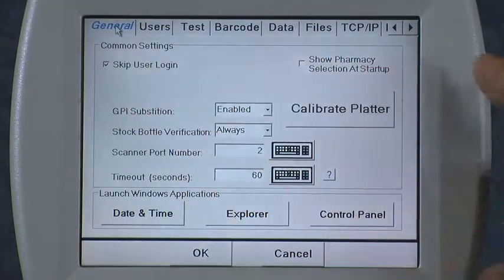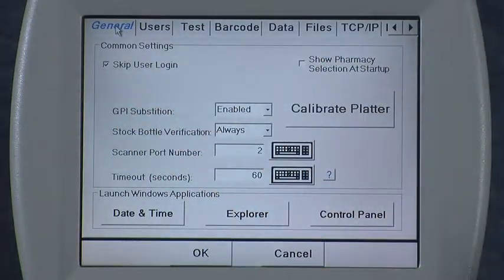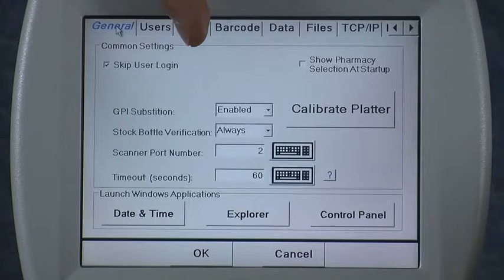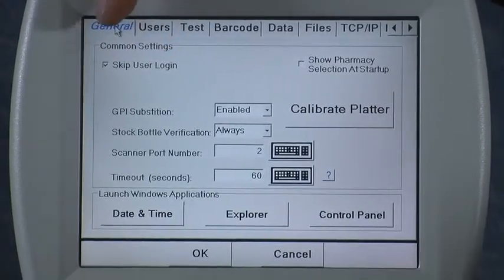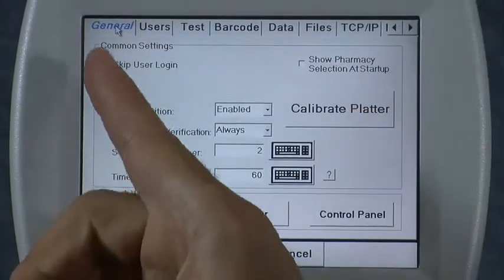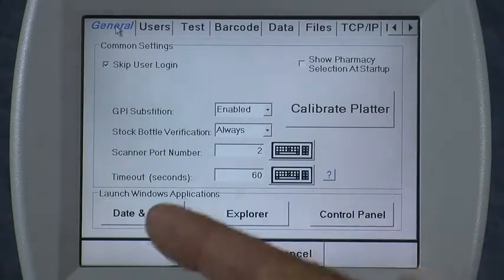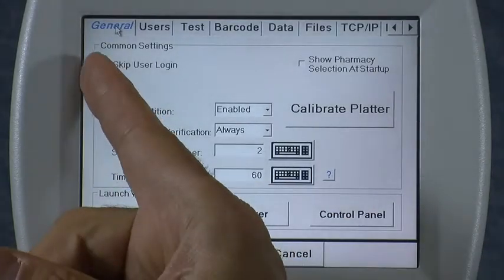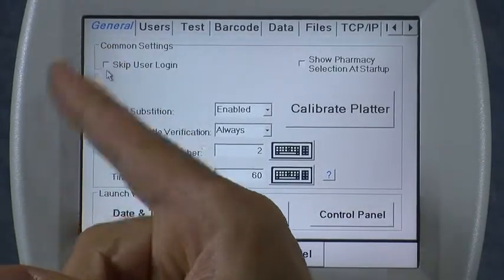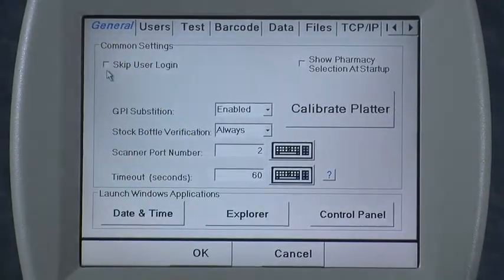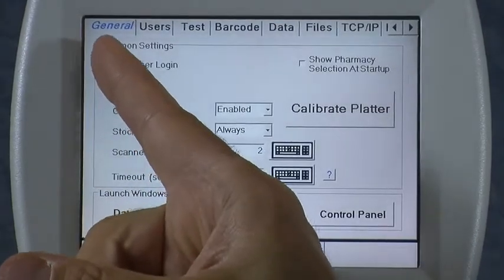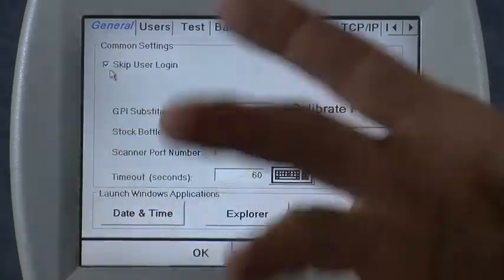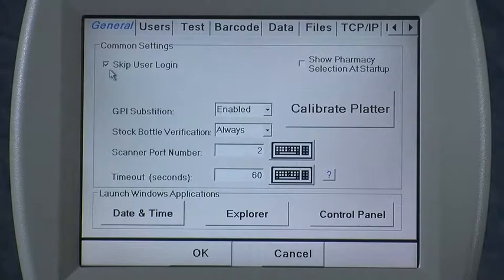On the General tab, here are the various features that you can access. Number one: Skip User Login. If you want to use login, you uncheck this box by simply tapping the screen there. By default, login is skipped, so it will not ask you to login when you're using the icon.